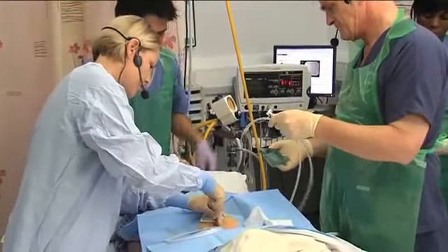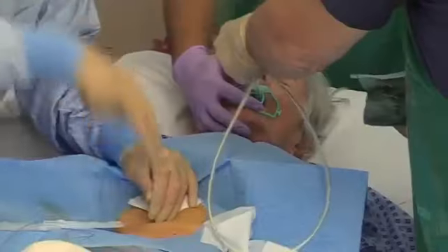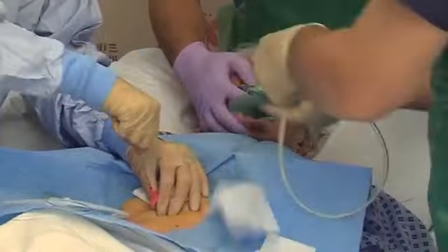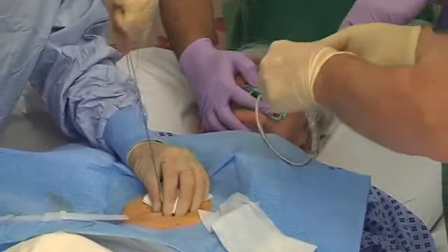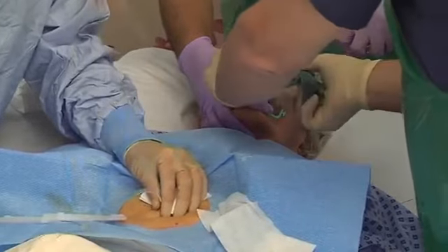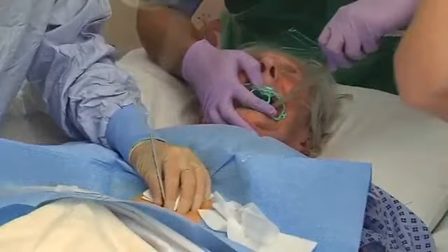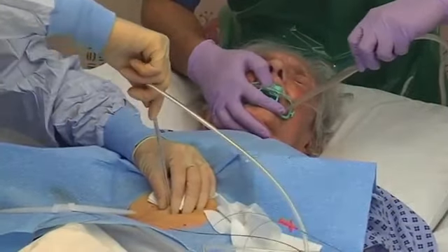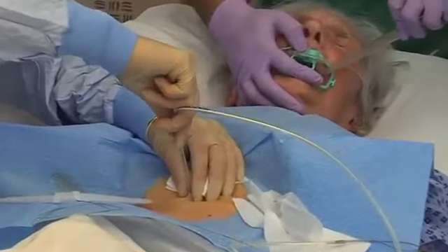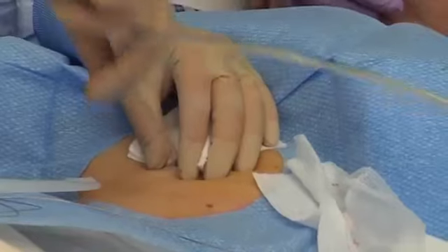Okay, and we're just going to pull the wire until I hit the knot. Okay, just a little bit of discomfort there. There we go. Well done. Okay, just take the trocar out. Plenty of KY jelly, and just feed the bumper in through the mouth guard. When you get to the right end, if you don't pull too hard, just watch so you can see the measurements on the tube. Okay, that looks good.